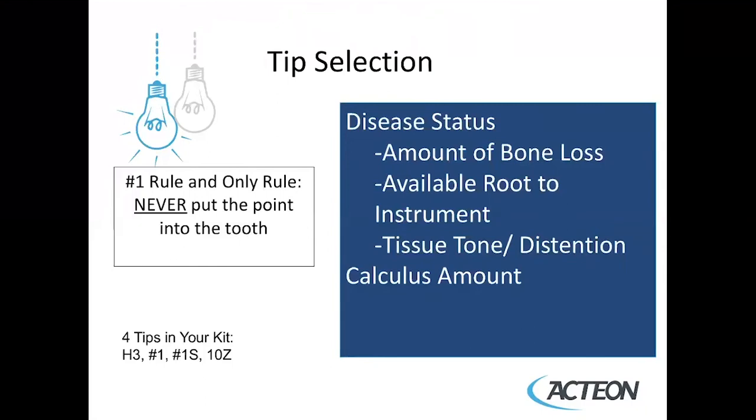In your kit, you have four tips: the H3, the number one, the number one S, and the 10Z. We'll now take a look at each of these tips and relate it to the clinical purpose for which you will use them.